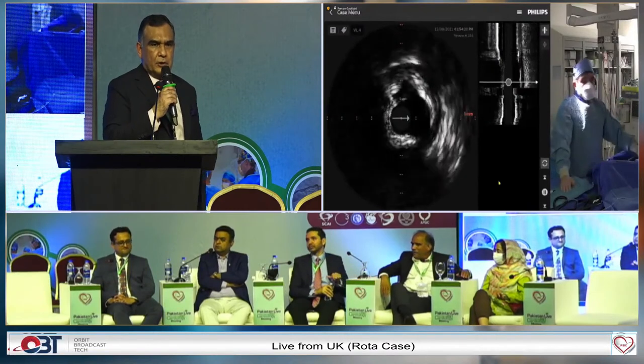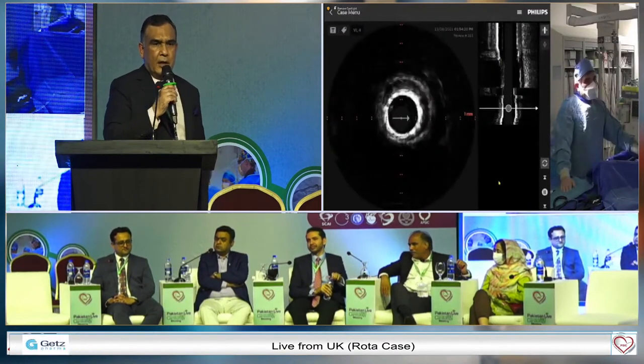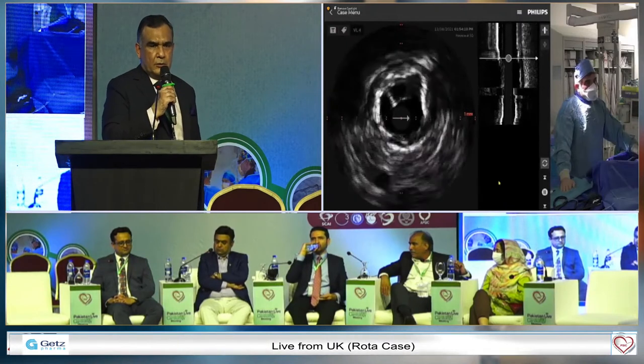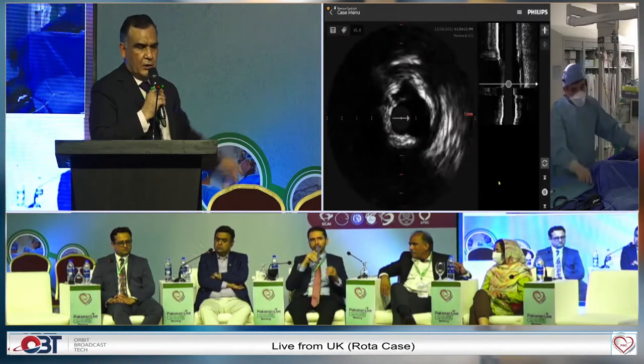So what's the harm in just cracking it, looking at it on IVUS, and if your balloon dilates fully, then just don't use a higher burr? So that's the argument that Dr. Javed Sayal has just put up.